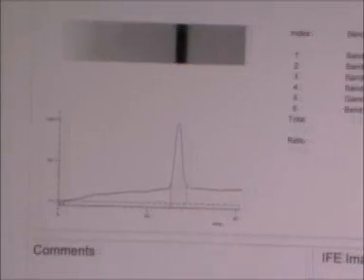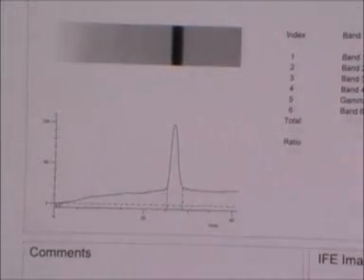Track 5 shows a strong, fast running A band, this time with no A2 band.